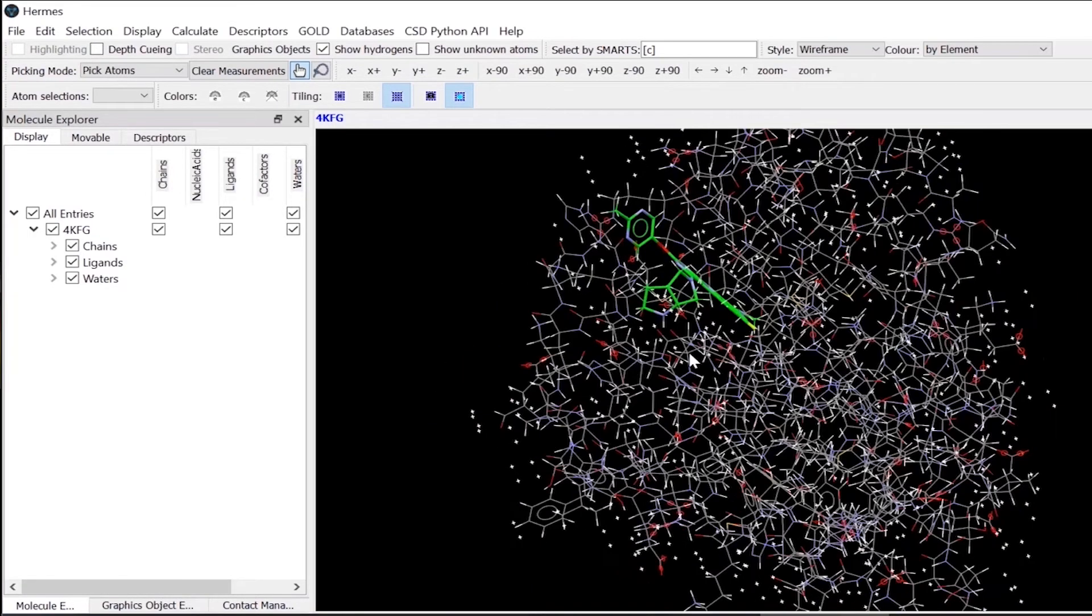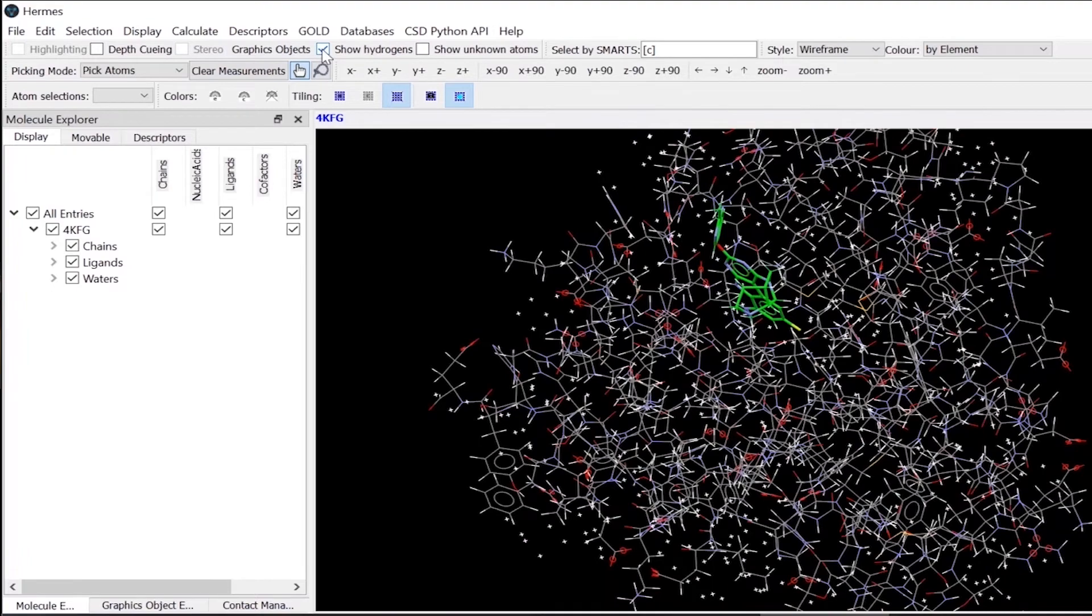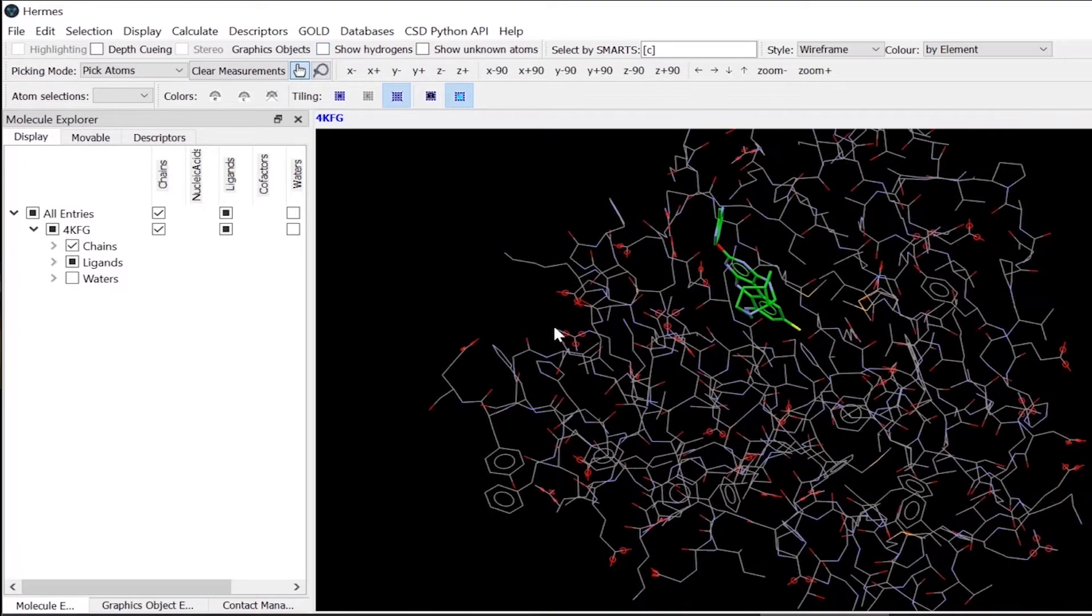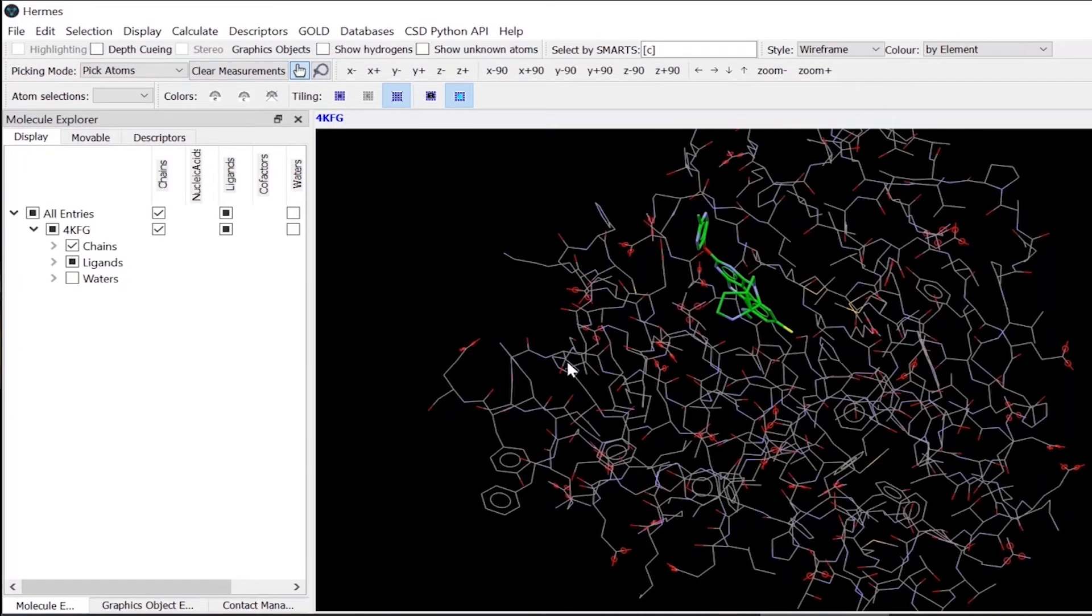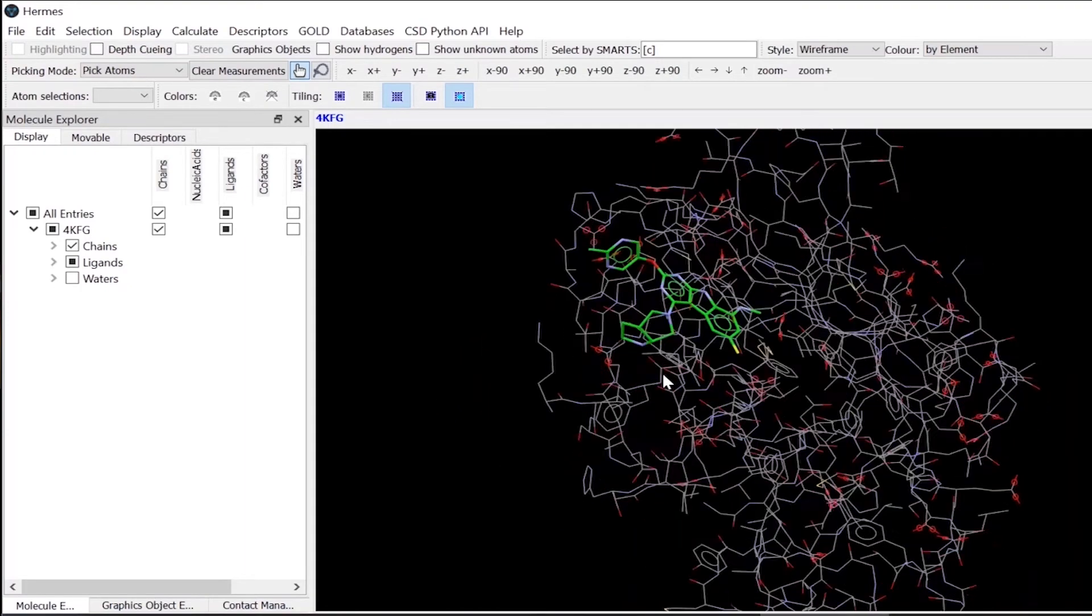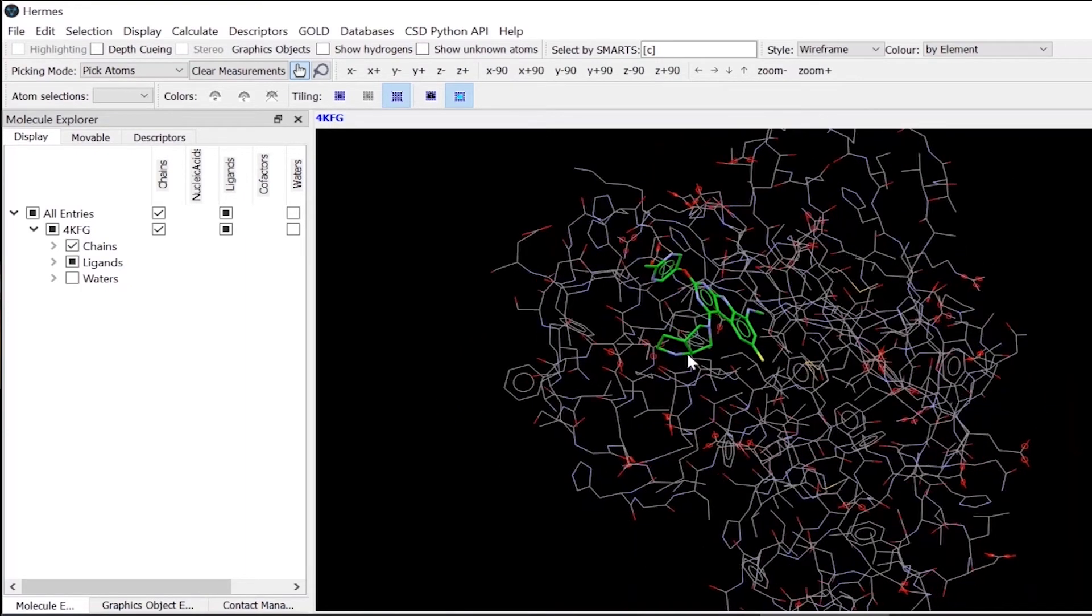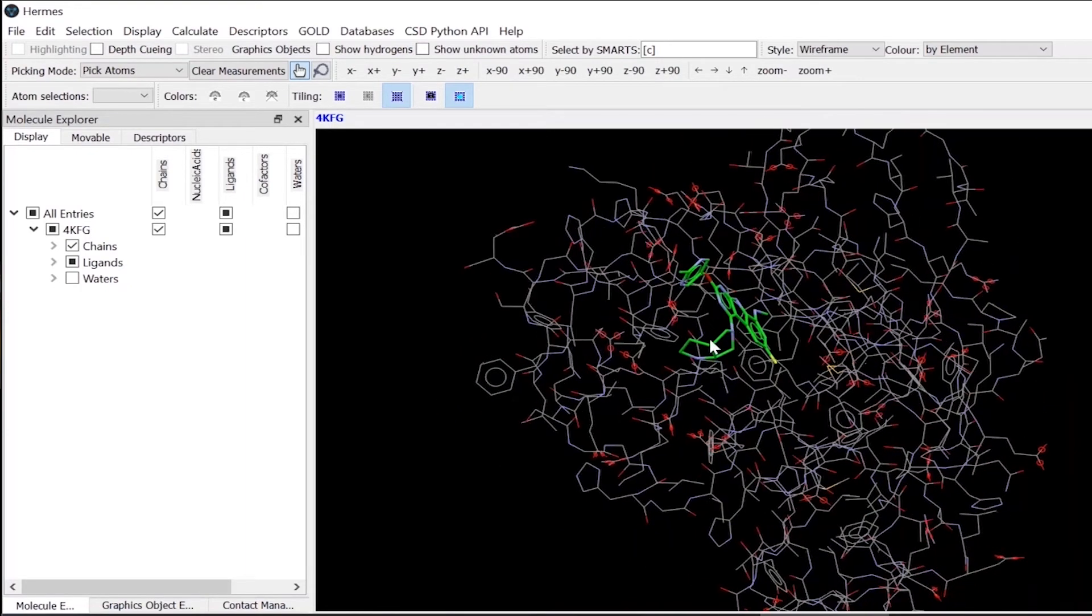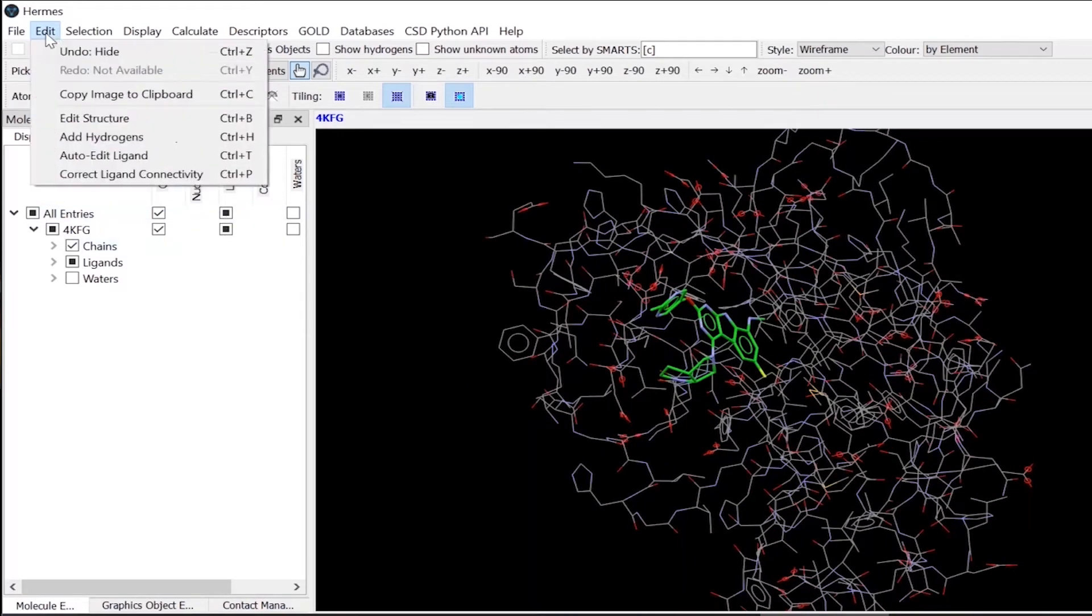So then we can, for clarity, turn off the hydrogens from here. Similarly, you can also edit or check the geometry of the ligand molecules here, which you can do from this edit button.